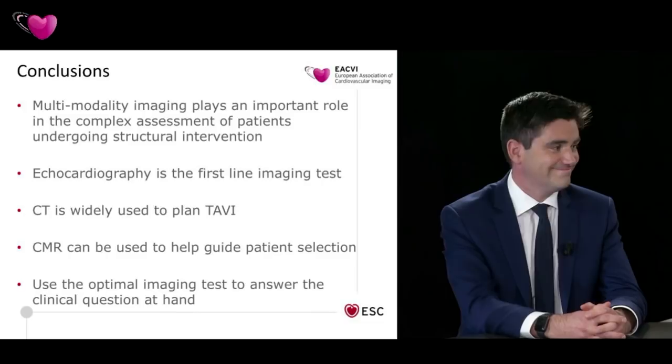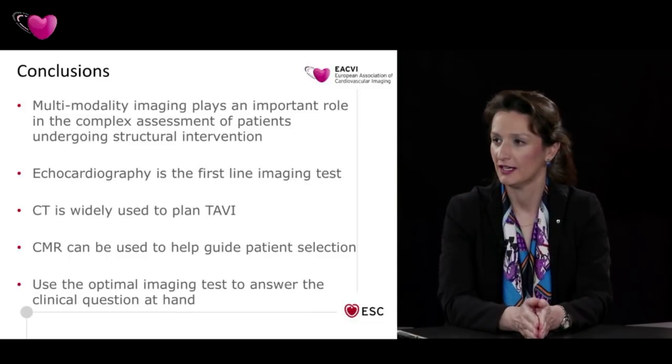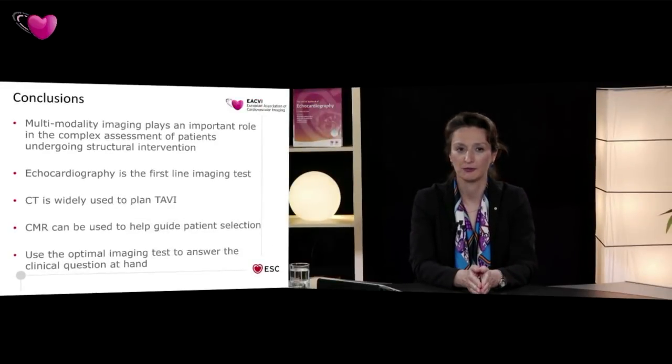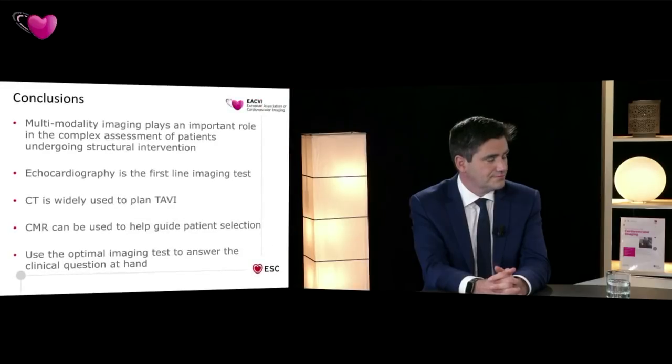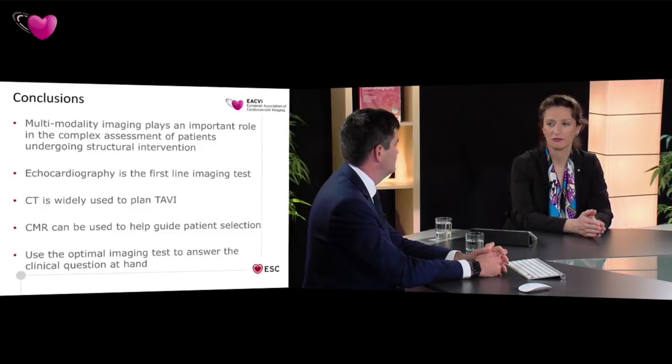That's excellent. And indeed illustrated very well how to use in a stepwise fashion every imaging technique that you have available in your clinical practice. We have some questions from the audience. Yeah. And that relate to this topic. One, for example, is the use of delayed enhancement in MRI in patients with heart failure. The absence of late enhancement excludes completely the ischemic etiology. How confident are you that maybe that patient cannot have a coronary artery disease?